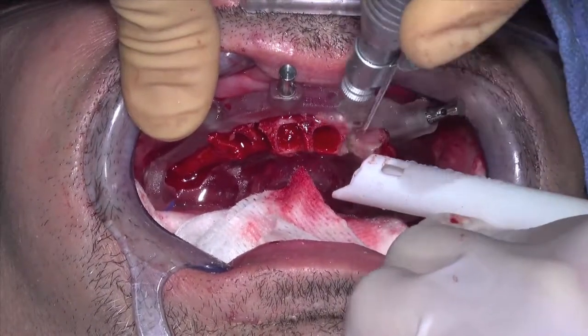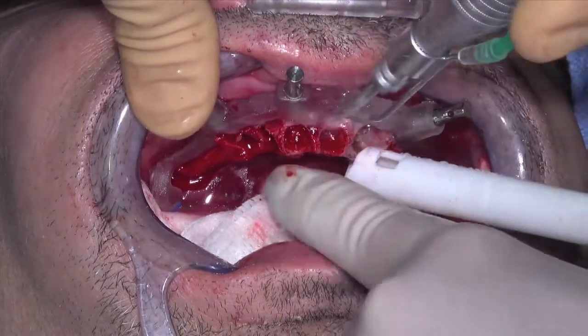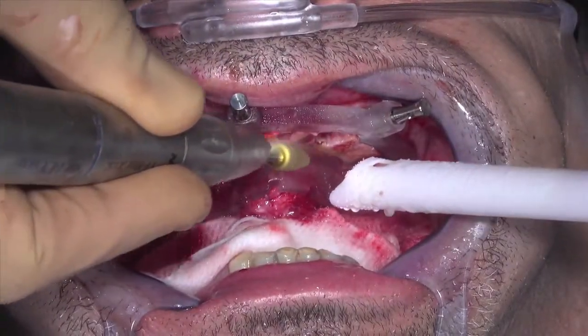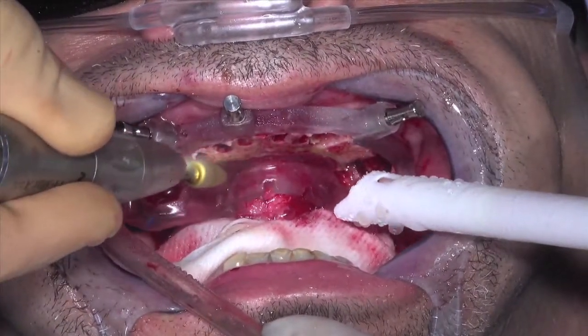Clinicians can use the buccal and lingual flats of the bone foundation guide for proper positioning of the saw blade. A third option is to use a large bone reduction burr of choice. It is the clinician's choice for bone reduction protocol.